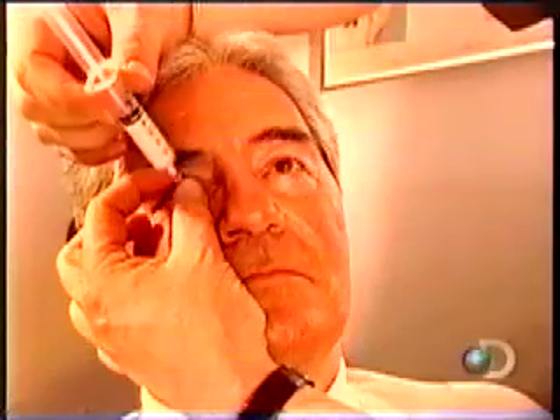If you've lost an eye in an accident or to a disease, a specialist known as an ocularist can fit you with an artificial eye. You can get a ready-made model or a custom-made prosthesis, like the one for which this patient's being fitted. No two people's eye sockets are the same, so the first step is to take an impression.